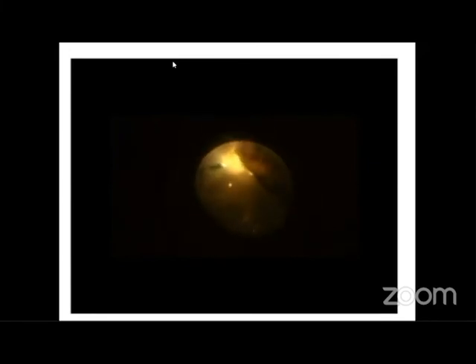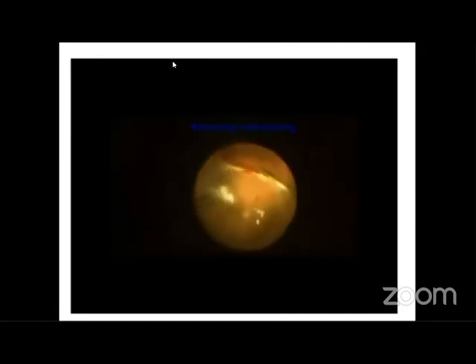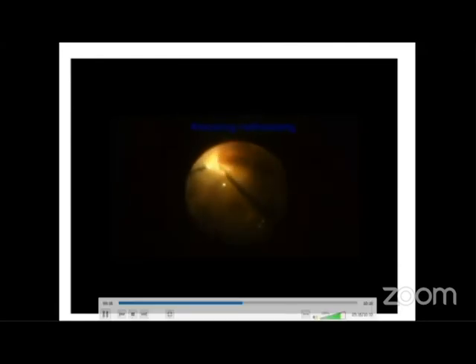Once the retina is relieved of surface membranes, PFCL is injected to settle the posterior pole of the retina. In ARN, it is necessary to dissociate the scarred and the necrotic area from the normal retina, as chance of proliferative vitreoretinopathy is high.